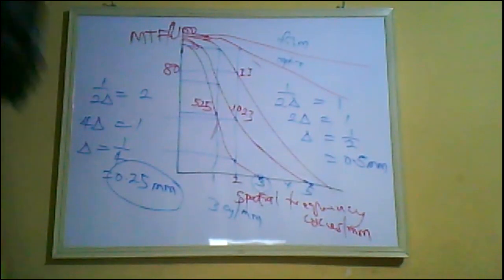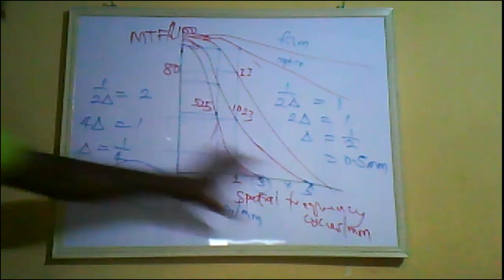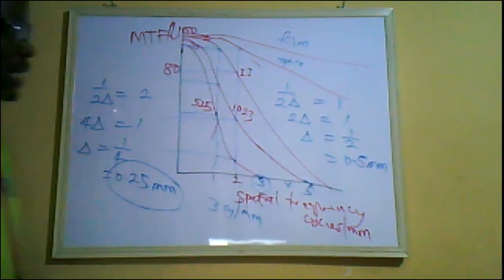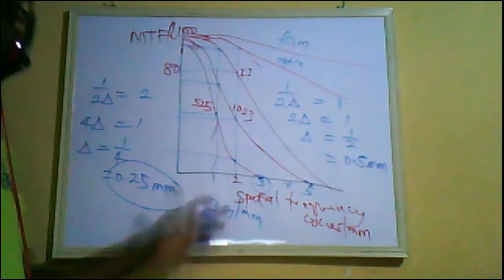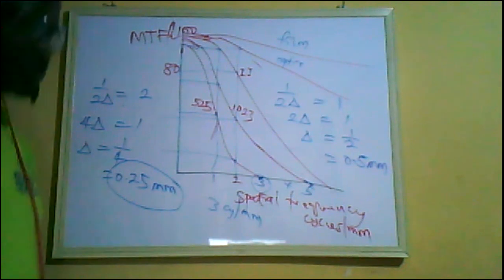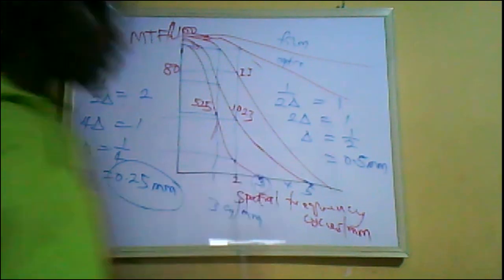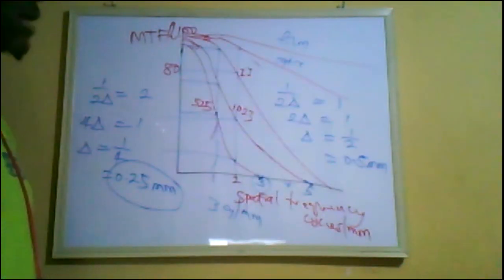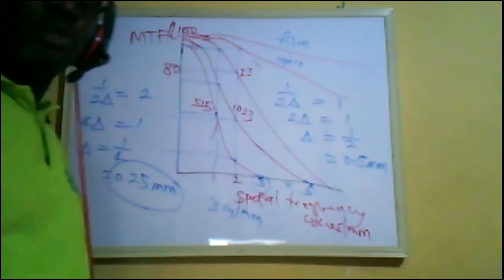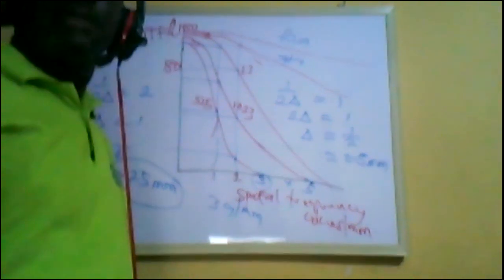So we can see from the graph that as the object becomes smaller and smaller, the spatial resolution continues to decrease. So it places so much of a burden on that system. It gets to a point where you wouldn't be able to distinguish the objects correctly again as their sizes become smaller and smaller and smaller. So let's continue.